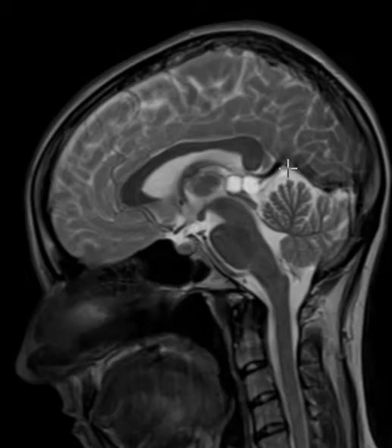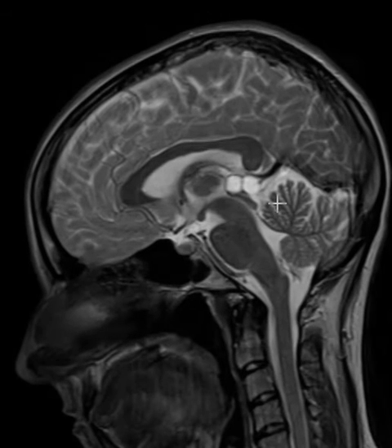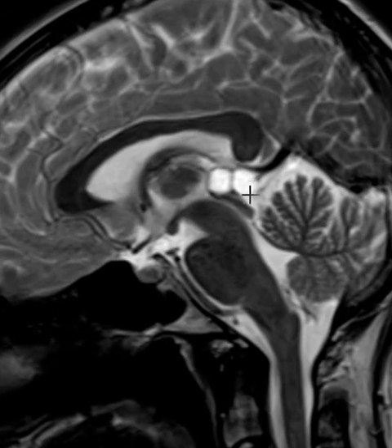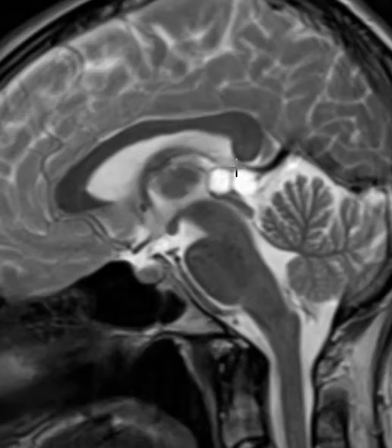Again, a 3-to-1 female to male ratio, and again, these are seen in about 5% of people, just incidentally, like probably in this case. So this is the cyst. There's a little plate below it, this little band. This is called the tectum, or the tectal plate. The cyst sometimes can push down on that tectal plate, and there's a little channel beneath the tectal plate and above this thing, which is the midbrain. This is called the Cerebral Aqueduct, or the Aqueduct of Sylvius.